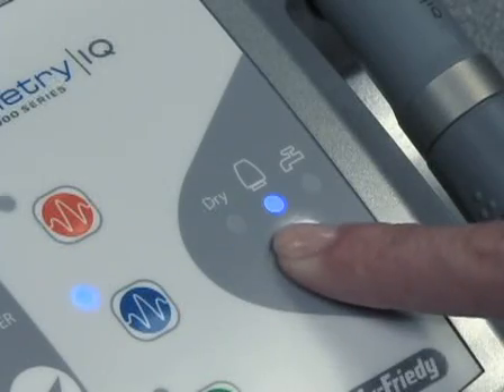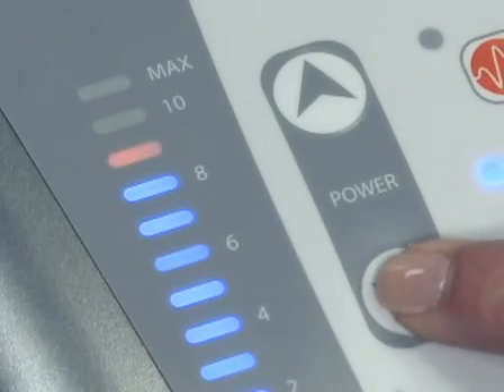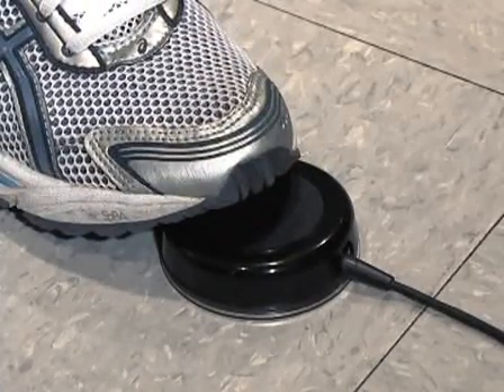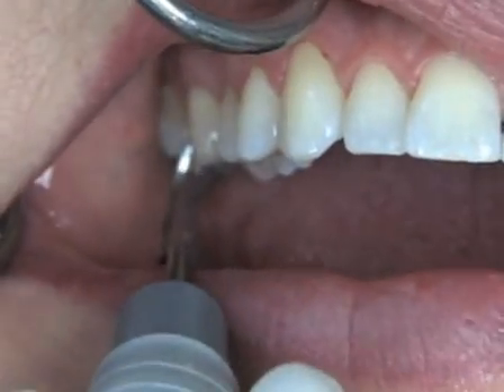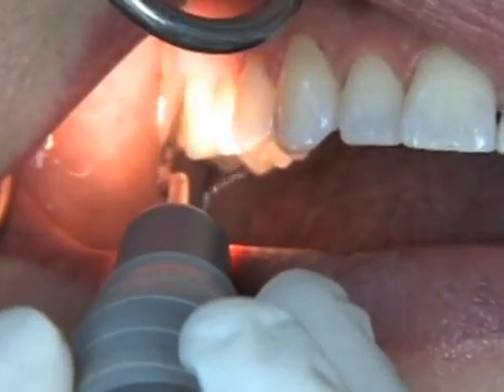The light on the control panel under the selected source will illuminate. Once the power level is adjusted to the desired range, depress the foot control to start tip vibration. The fiber optic light will illuminate and the operating light stays illuminated while the tip is vibrating.